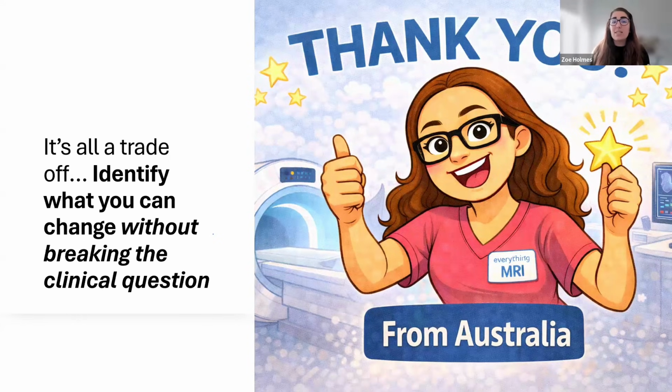A practical way to build confidence is to do deliberate practice. So after each scan, pick a parameter and say, what would happen if I changed this parameter by such and such? Then compare your prediction to the reality and the outcome. This will build your intuition from a junior level up into a more advanced level. Everything in MRI is play.